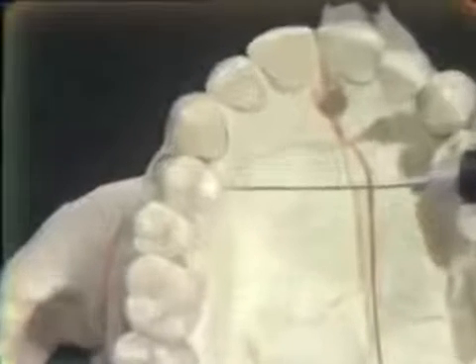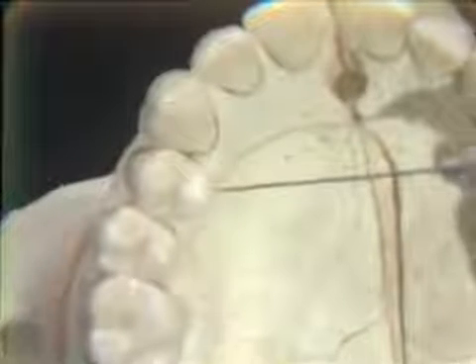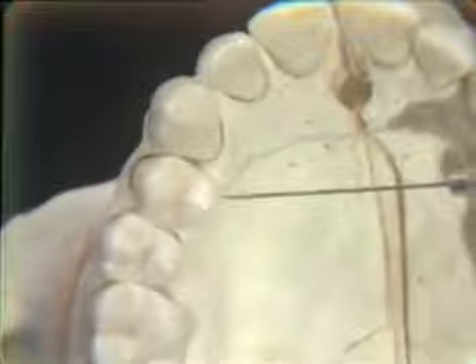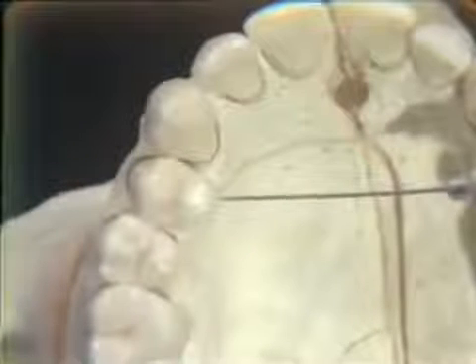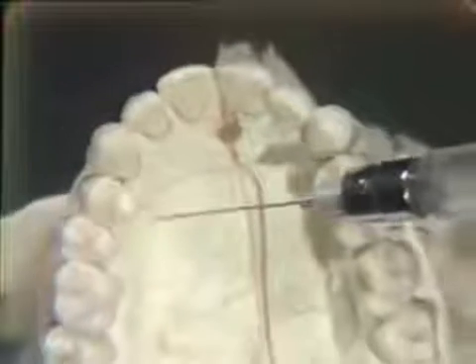And again, with a little pressure on the plunger of the syringe, and it does take a little pressure, expel a few drops out into these tissues. Needle bevel is against bone again. And as you see the tissues blanch, you will know that you've got some solution out into the tissues.